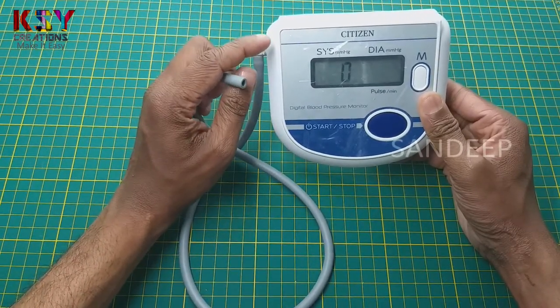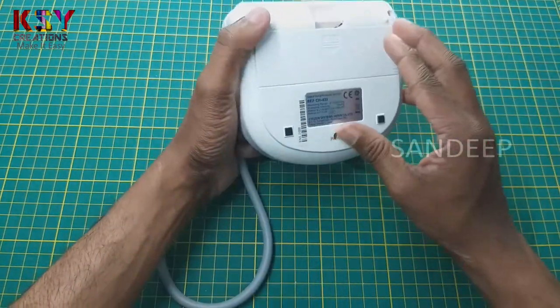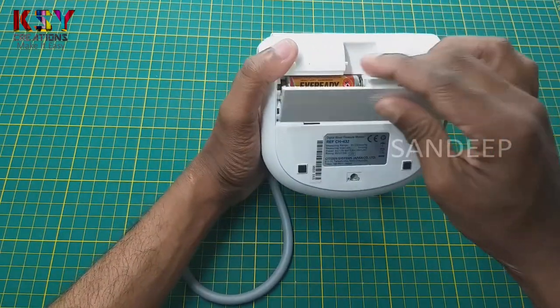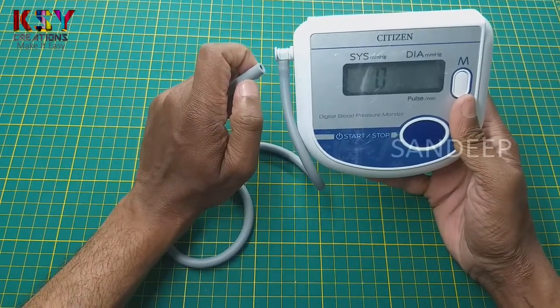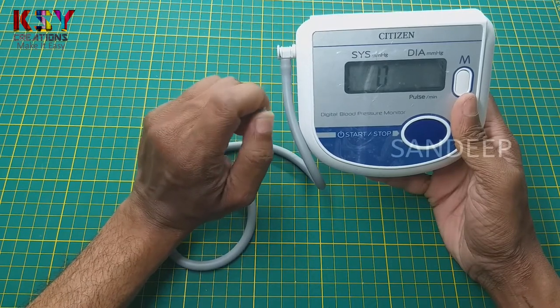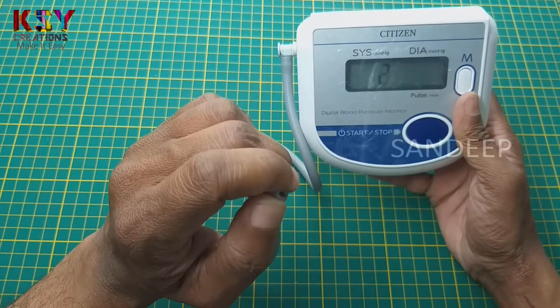You can hear the pump sound. This device works with 4 AA batteries. We will open this device and remove the air pump. You can hear the air sound from this pipe.